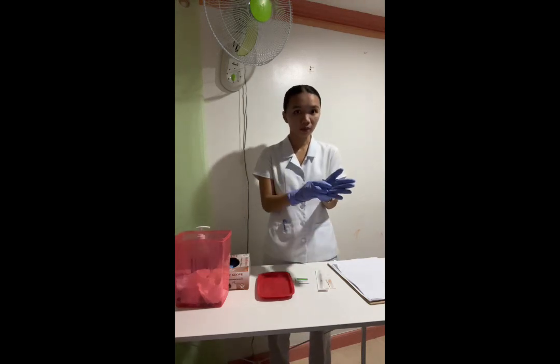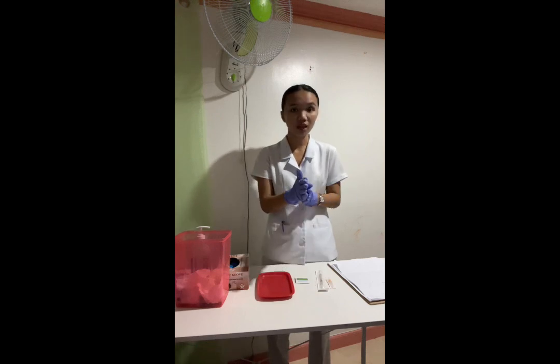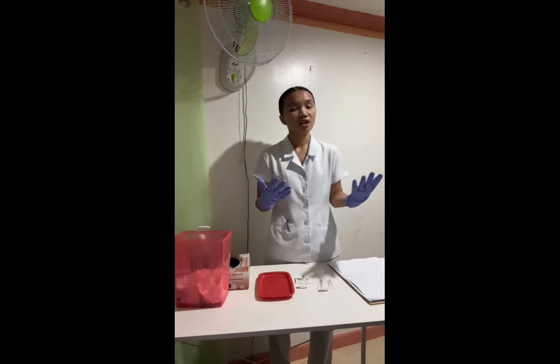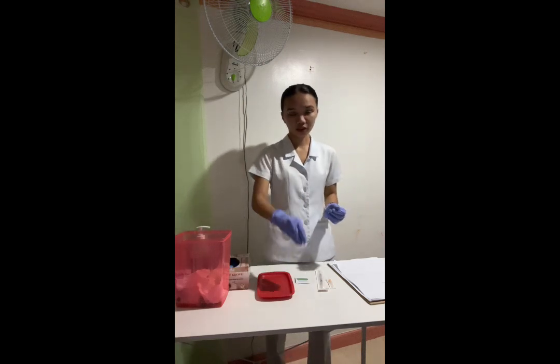So now we have to prepare the medication vial for drug withdrawal. So first, we are going to mix the solution if necessary, if there is, by rotating the vial between our palms and not by shaking. So we are going to do this because some vials contain aqueous suspension which settle when they stand. And in some instances, shaking is contraindicated because it may cause the mixture to foam. Now we're done.